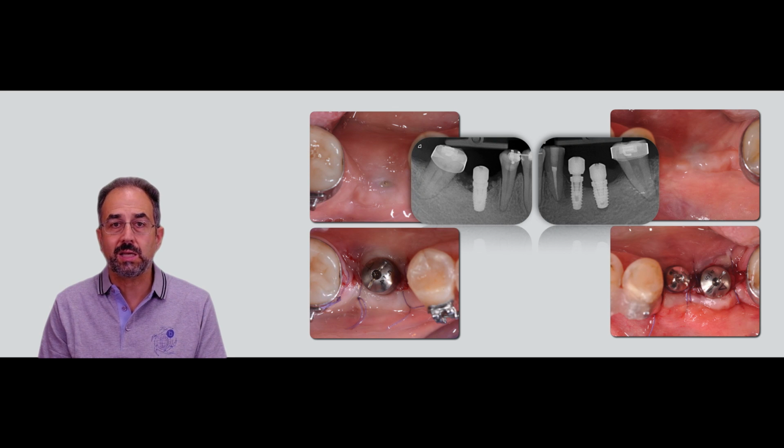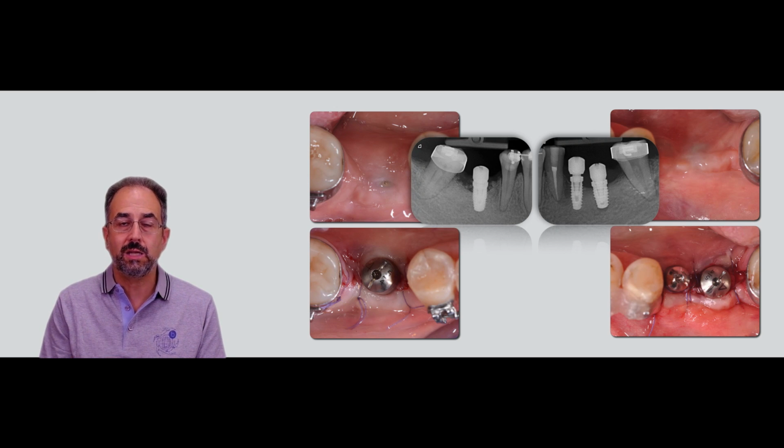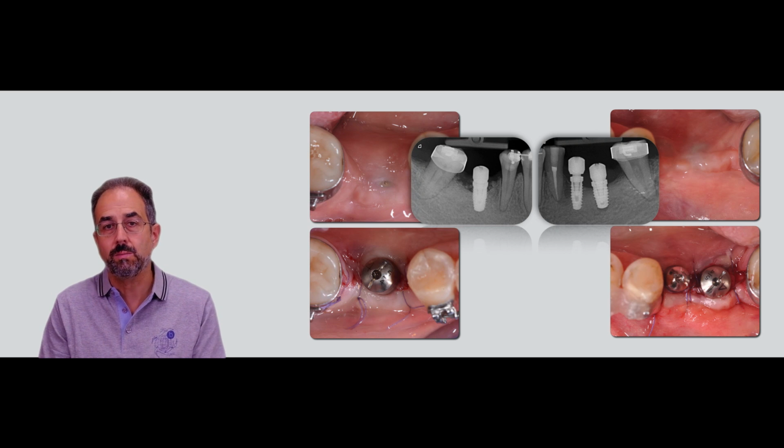This x-ray was taken at the time of uncovering of the implants and placement of healing abutments. The first of the 2 implants on the left side did not have the healing abutment properly placed, then we fixed it, but I did not take a new x-ray.